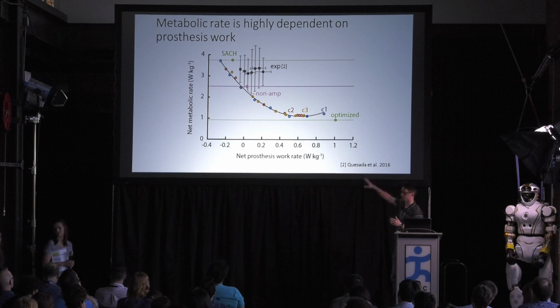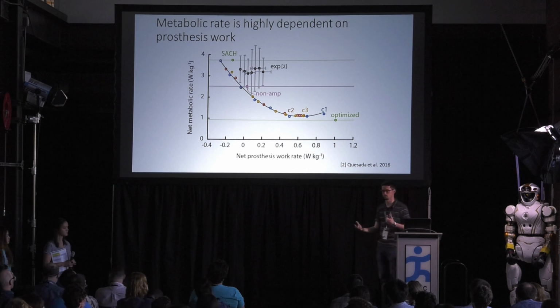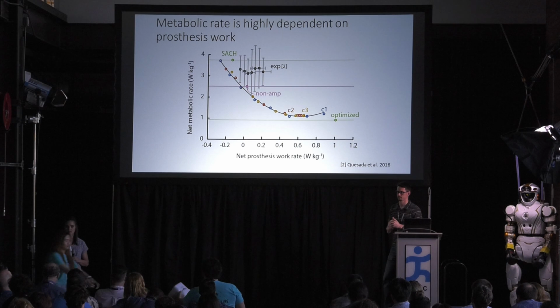Now I don't know how it would change if we increased the speed. Maybe we would see a further decrease, or if we allowed it to change velocity or something like that. But at this particular speed, adding that much work is going to be a detriment.